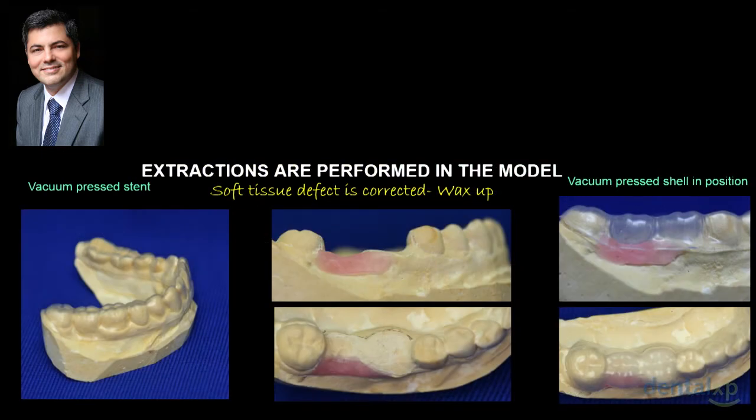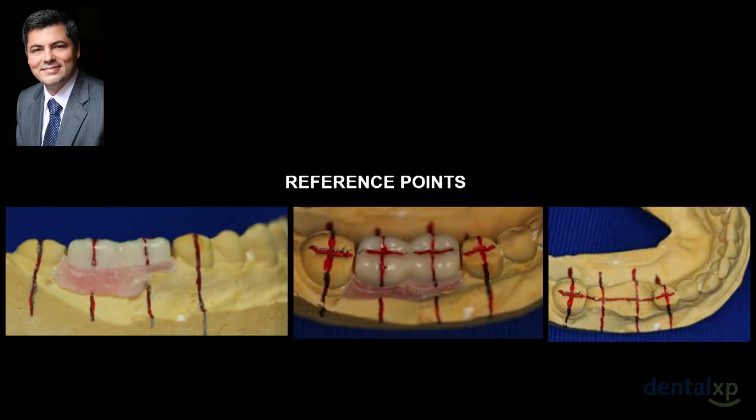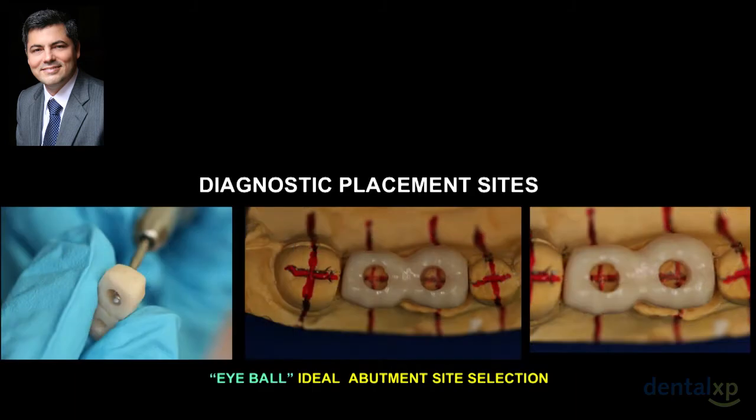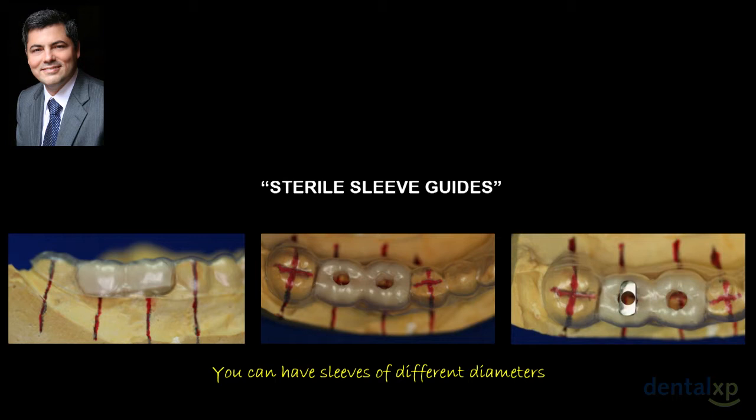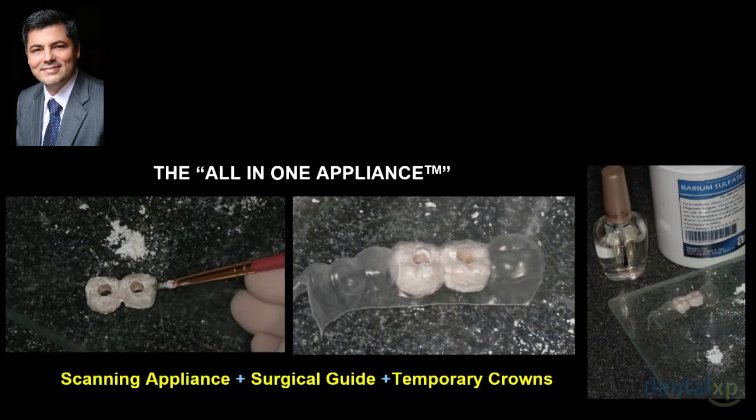We went through the construction of the device and created the reference points, created the diagnostic placement sites, the DPS, which is a concept that we developed together, Dr. Picos and I, several years ago. And it's a concept that goes along with the triangle of bone of Dr. Gans. We put together some sleeve guides to guide the burrs.